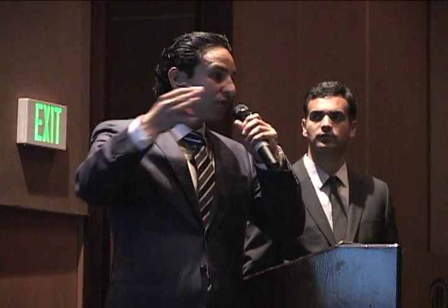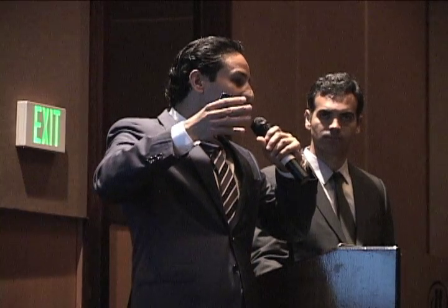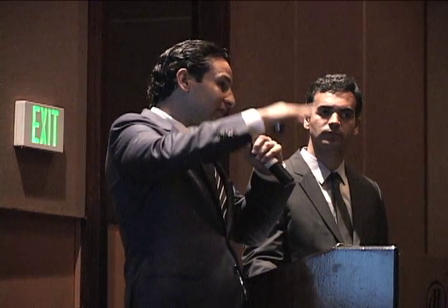And you can also get dehiscence of the wound. So sometimes the wound doesn't close over. Okay? Especially, I find that if you don't place the implant deep enough, then the gum cannot cover over, because everything likes to go in an area of least resistance. So as the gum is closing over, if there's any kind of foreign object in the way, it might just stop, and it doesn't like to climb. So you need to always have it going in a downward direction. So placing your implants deeper.